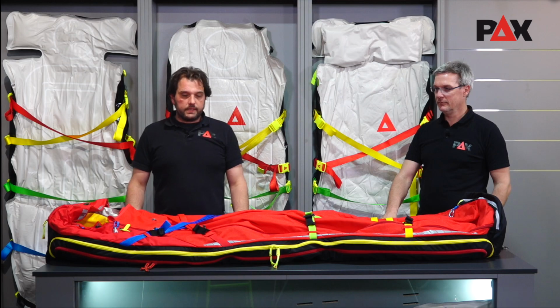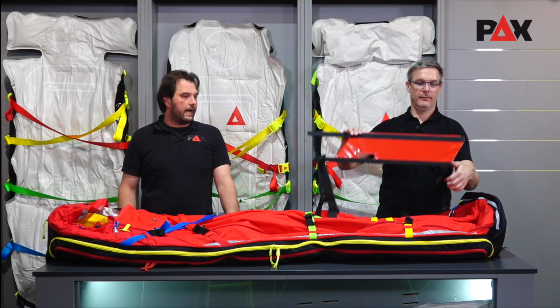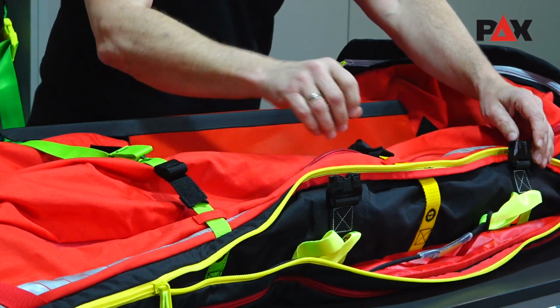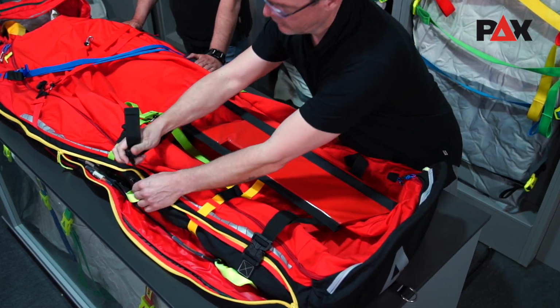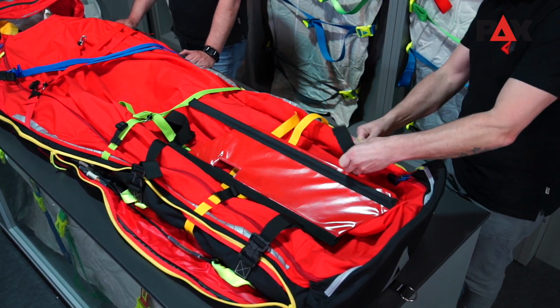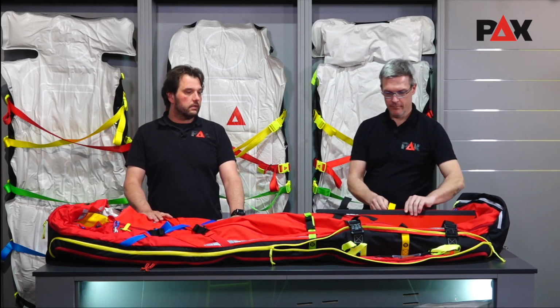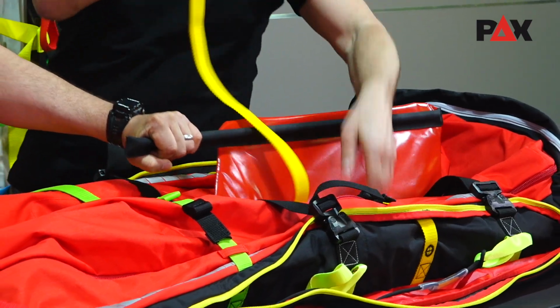In some cases, you want to install an anti-rotation device at the end of the rescue bag to stop it from rotating under the helicopter. Therefore, we have buckles in the same pouch where we have the slings for the attachment harness, and you can easily attach the anti-rotation device to those buckles, and you will quickly install this device, and then the operator that is lifted together with the patient can operate the anti-rotation device while flying.